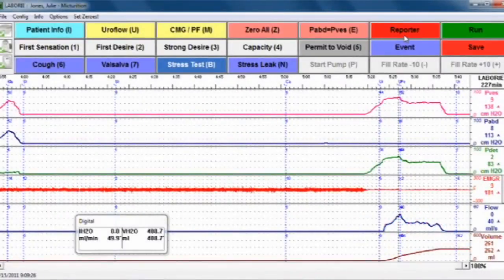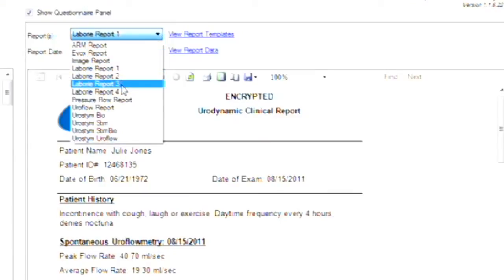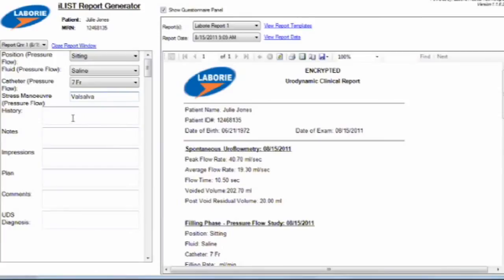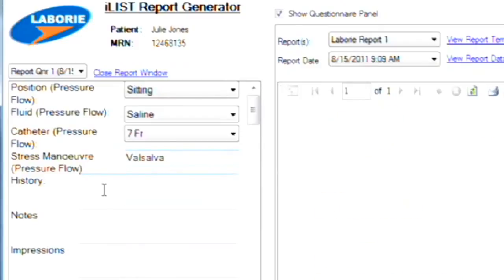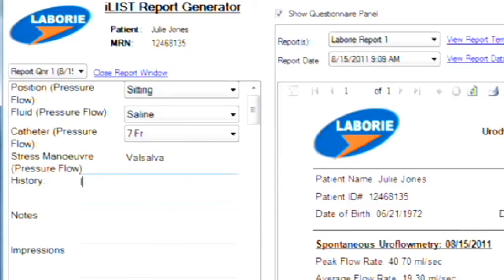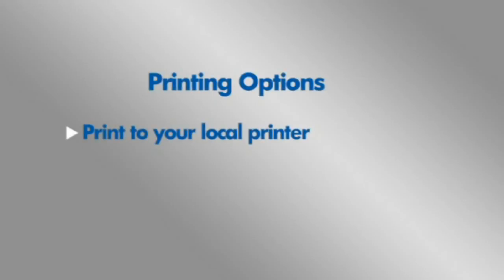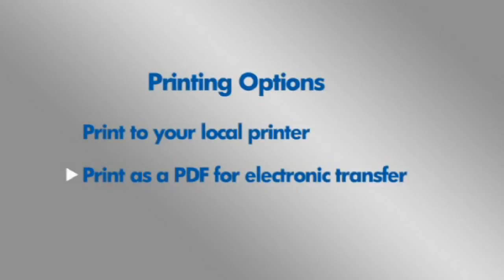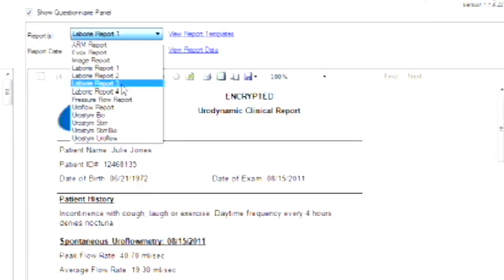To print your report, click the reporter button and agree to save the test when prompted. Choose your preferred report format from the drop-down menu. There are different styles depending on the preference of the physician. Make any notes or additions to the report by using the boxes on the left of the screen, including places to type the patient history and impressions from the study. Click the printer icon to print. You can choose to print to your local printer or as a PDF for electronic transfer. Please refer to the owner's manual for greater detail on choosing different report styles or printer setup.